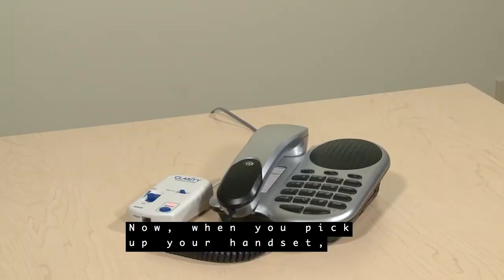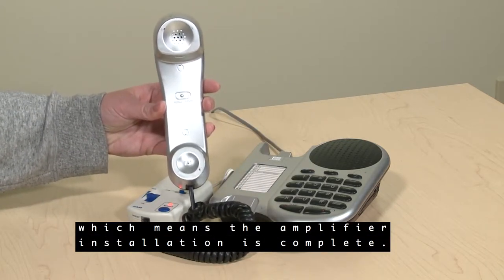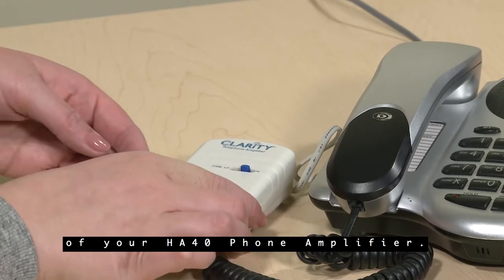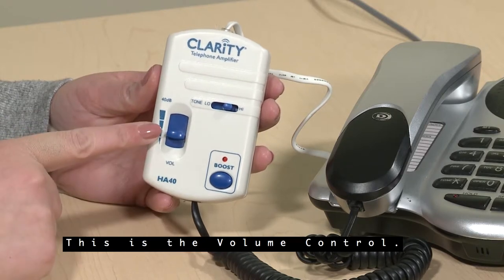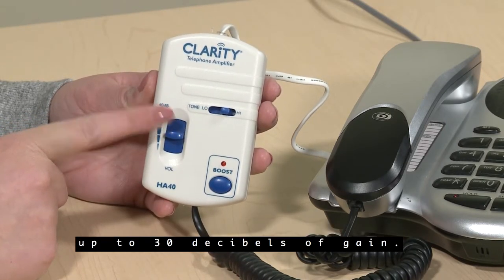Now, when you pick up the handset, you should hear a dial tone, which means the amplifier installation is complete. Now let's take a look at the features of your HA40 phone amplifier. This is the volume control. Slide it up or down to adjust the volume up to 30 decibels of gain.